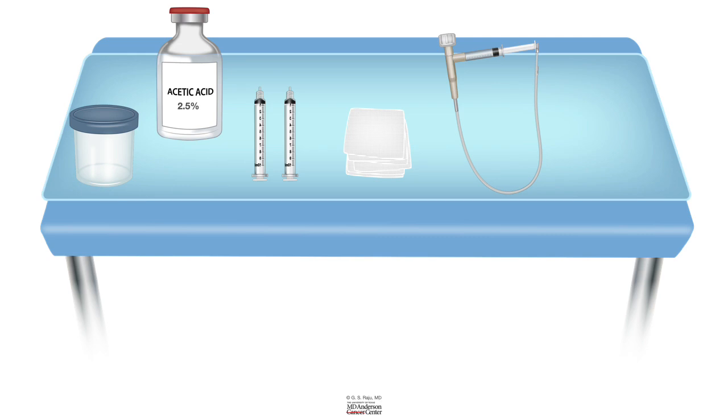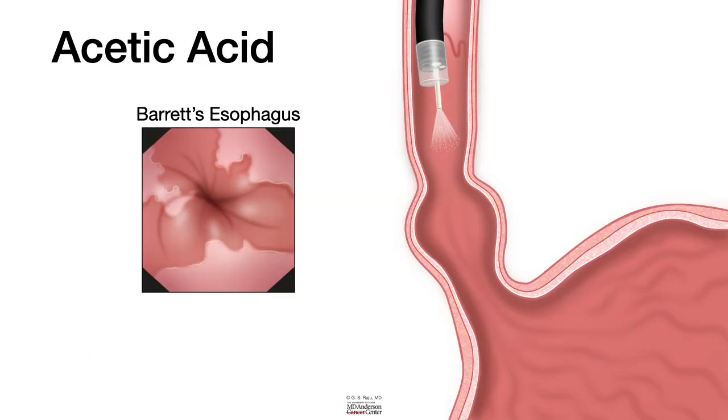And once the endoscopist has performed endoscopy and has reached the gastroesophageal junction, he will ask for the spray catheter, and then the spray catheter goes through the biopsy port, and once it comes out, when the endoscopist says start spraying, you spray slowly.